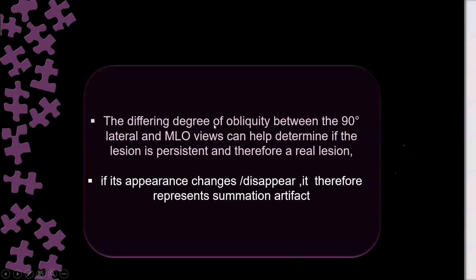So the differing degree of obliquity between the 90 degree lateral and MLO can help us determine if the lesion is persistent and therefore a real lesion, or if it changes in appearance or disappears, representing a summation artifact.